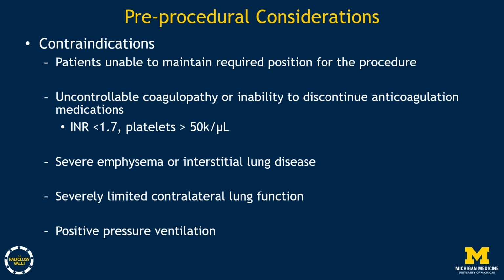Perhaps even more important than knowing when to perform a lung biopsy is to know when not to do so. Patients who are unable to remain still in the position required to perform the biopsy are poor candidates for the procedure, as motion will disrupt the millimeter precision required for safe and successful biopsy.